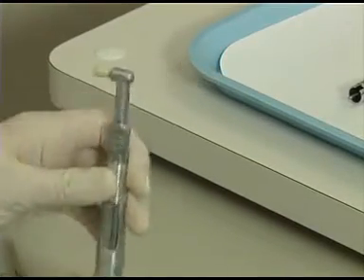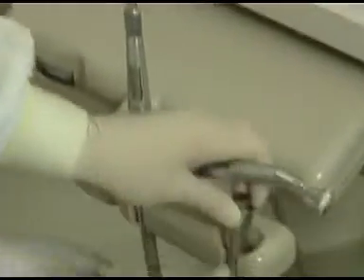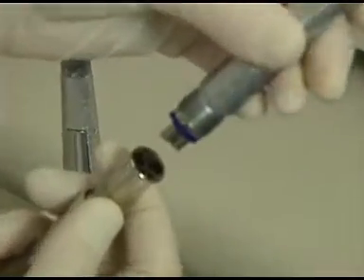The second handpiece for attachment is the high-speed handpiece. Attach it to the correct receptor, making sure it is aligned and tightened properly.